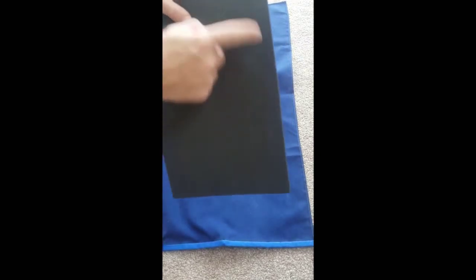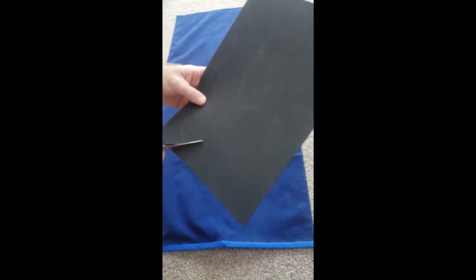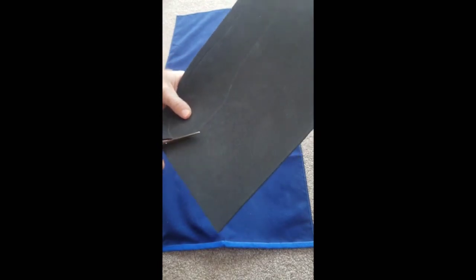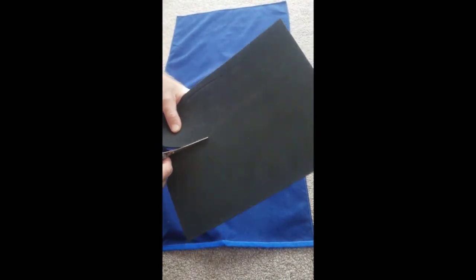So you can see the template's been transferred across to there, and then you just cut out the insole along those lines.